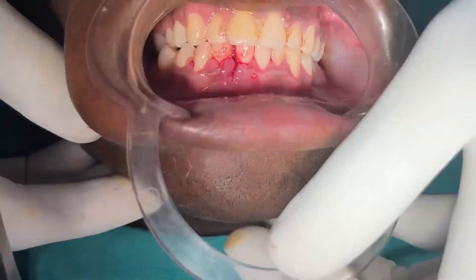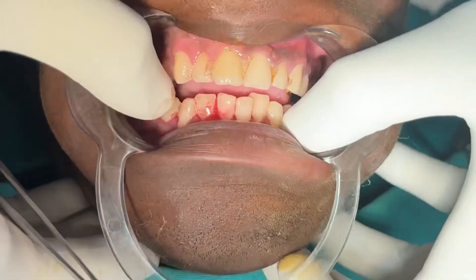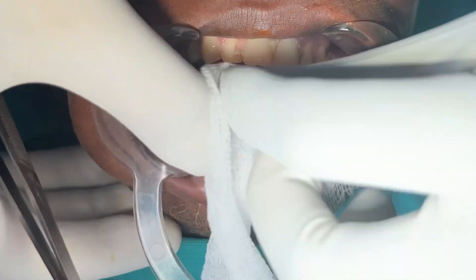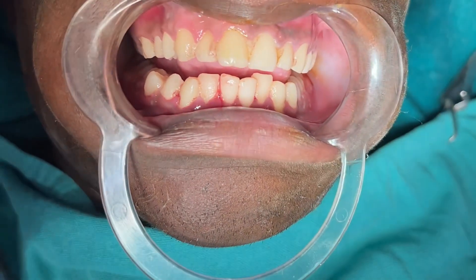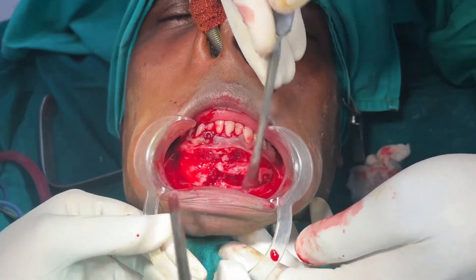Once we open up, you'll be able to see the other fracture inside, which is actually an unfavorable displaced fracture — it is displaced.